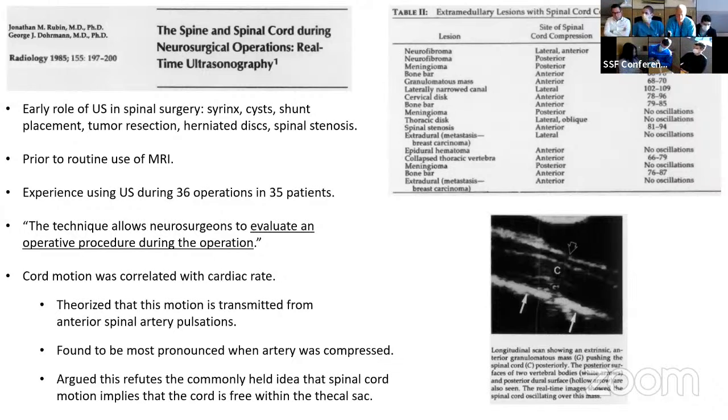One big question for me is, this is a hot topic in acute spinal cord injury, obviously, of intentional durotomy and CSF release to maximize cord perfusion. Is a leading expert like you able to see or estimate cord perfusion better intraoperatively with ultrasound, to get a better gestalt of how our cord perfusion is looking?